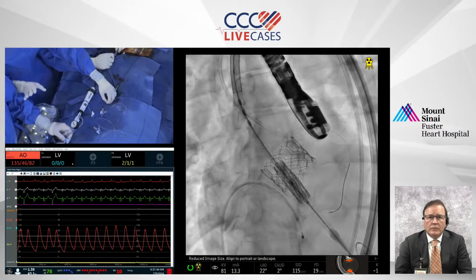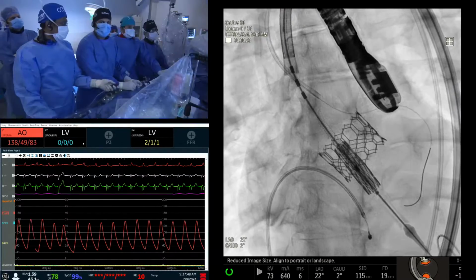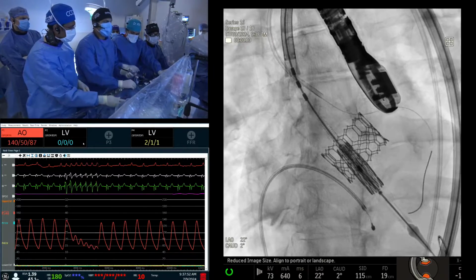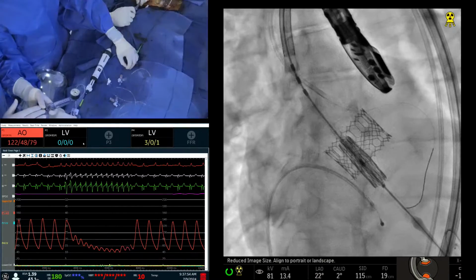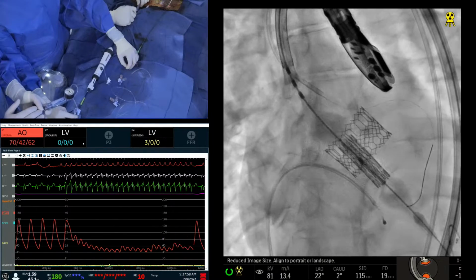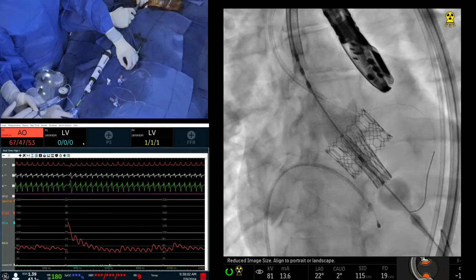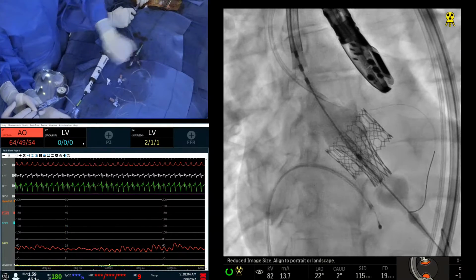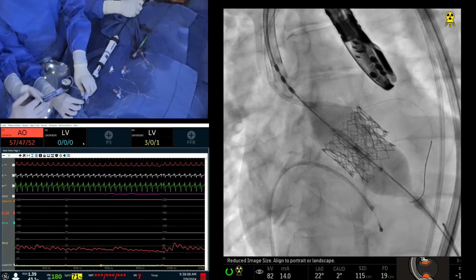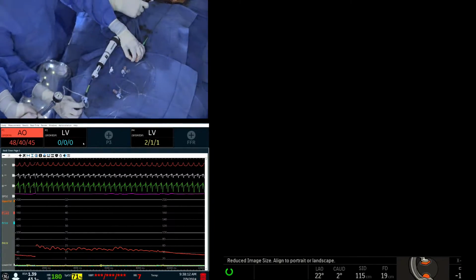Let me go on cine. Okay. Pacer is 180 for a second. Lungs down, please. Who's going to hold? Malvin, please. Okay, go up. Fluoro. Cine. Fluoro. Going up. Pull up, pull up. Push the wire a little bit for me. Okay, a little bit. Good. Don't worry. You'll be fine. All right. Nailed it.